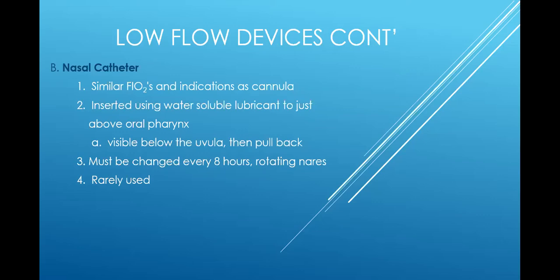But as far as the NG tube, Talisha, you would put that the same way. They just keep pushing it down. You tell the patient to swallow. When it gets in his throat, say swallow so it doesn't go in his airway and it goes into his stomach. They just keep pushing till they get to the stomach, and then they will put air in it and listen with the stethoscope in the stomach. And if I can hear air in the stomach when I push the tube, I know I'm in the stomach. Okay? That's how they do that.